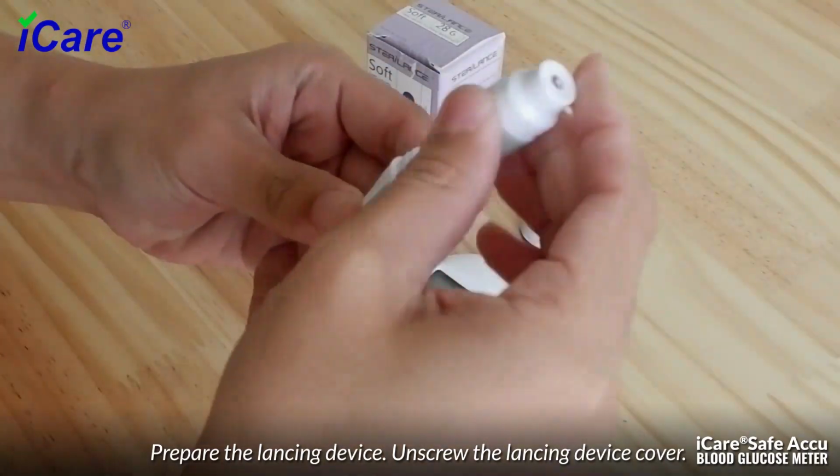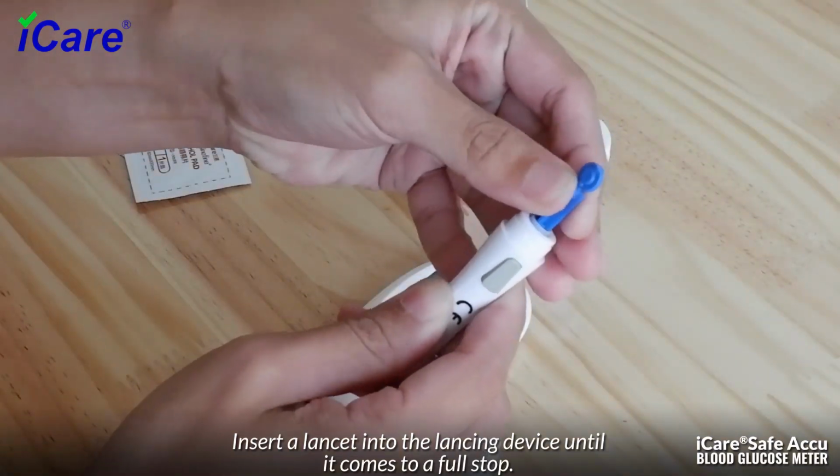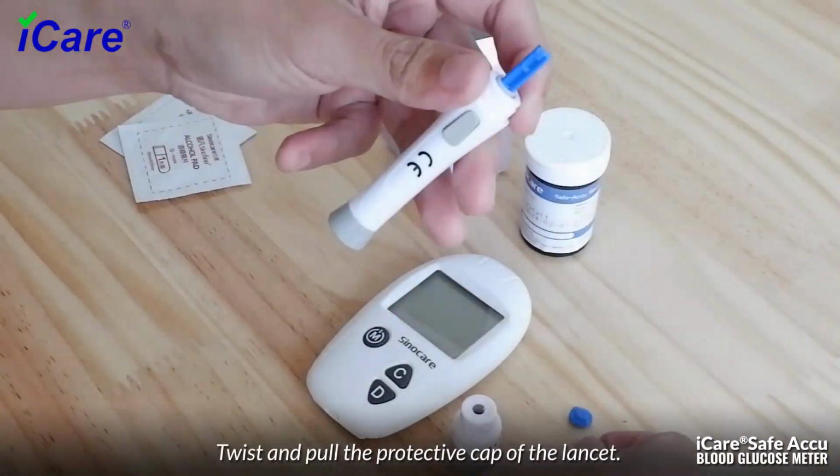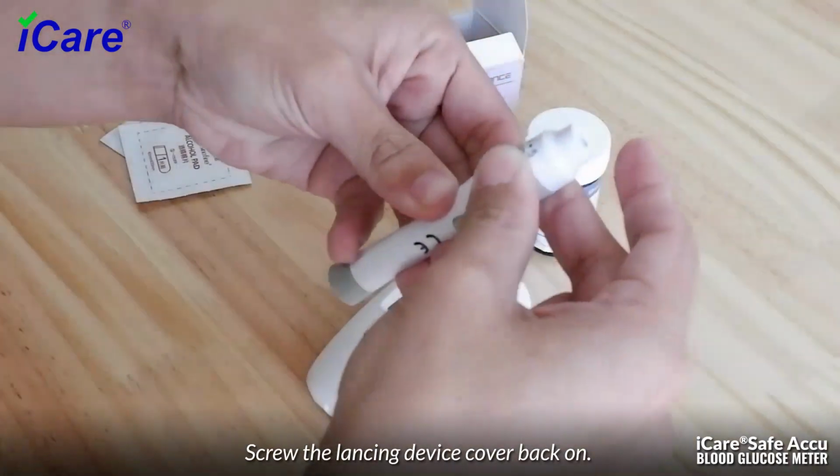Unscrew the lancing device cover. Insert a lancet into the lancing device until it comes to a full stop. Twist and pull the protective cap of the lancet. Set it aside for proper disposal. Screw the lancing device cover back on.